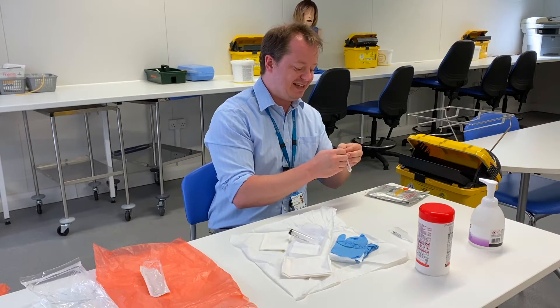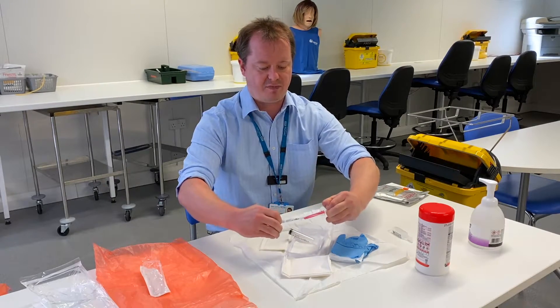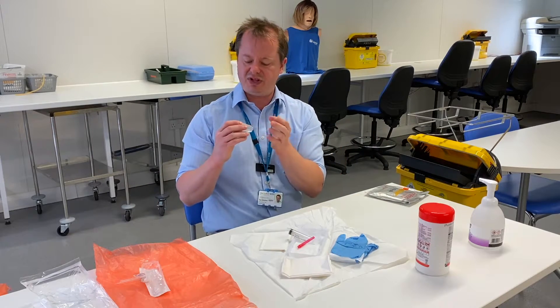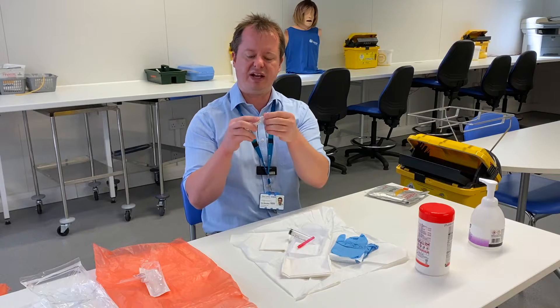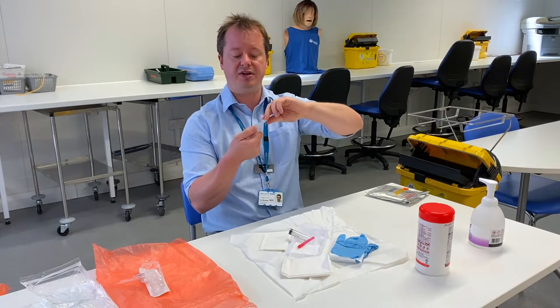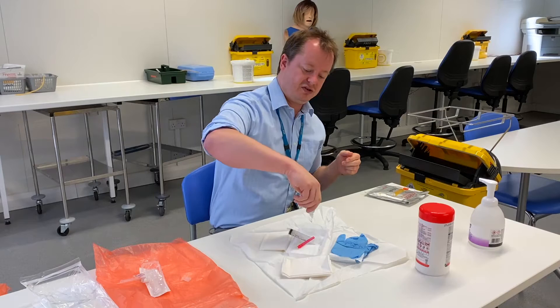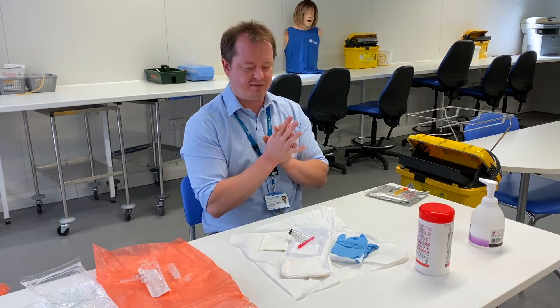The same with the needle — I'm going to make sure I don't touch any part of it, carefully open it and drop it onto my sterile field. And then the saline — I'm going to do all the checks I normally do for the saline, but I'm going to think that the outside packaging is all non-sterile and dirty. So what I'm going to do is open it very carefully and put the liquid inside the pot within the sterile field.